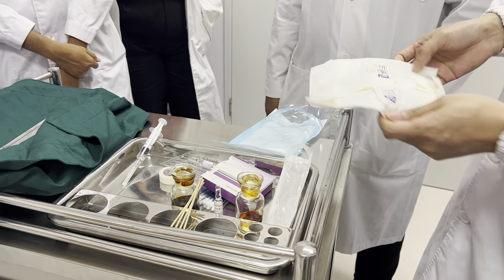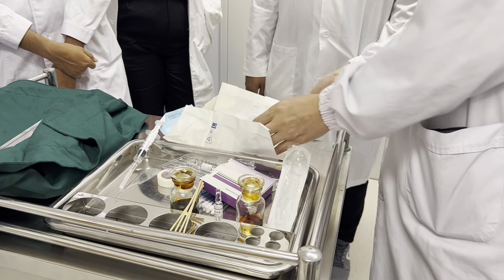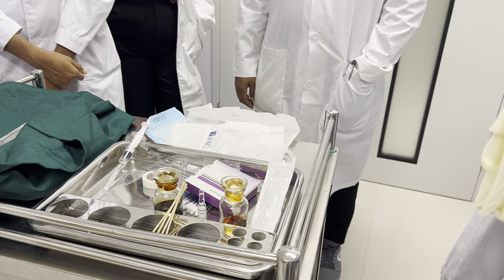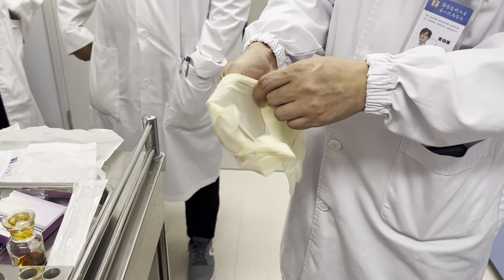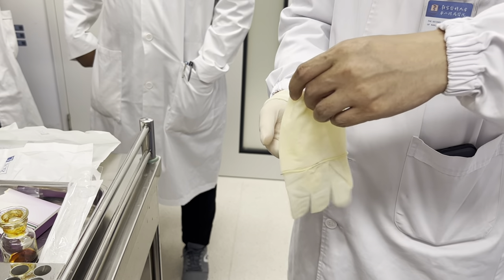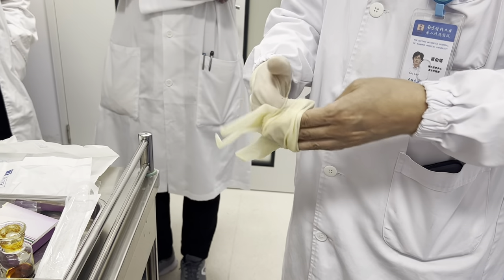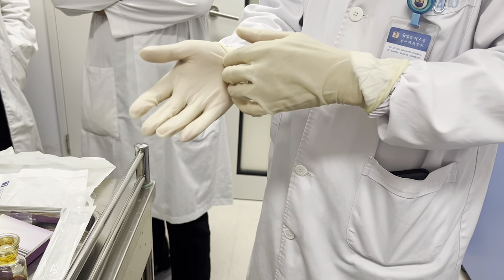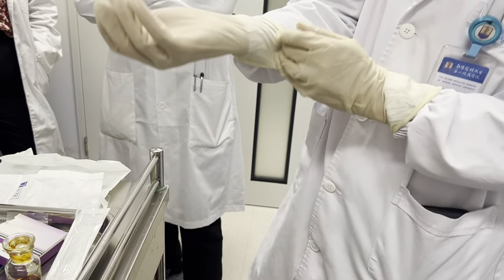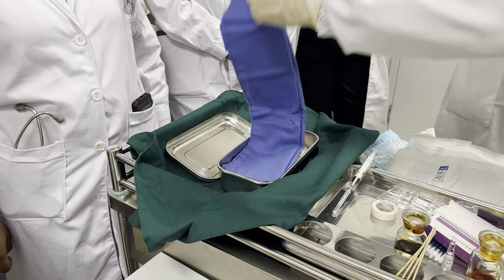Don't you wear the covers? Do you know how to wear the covers? Yes. Okay, we need a cover here, please.